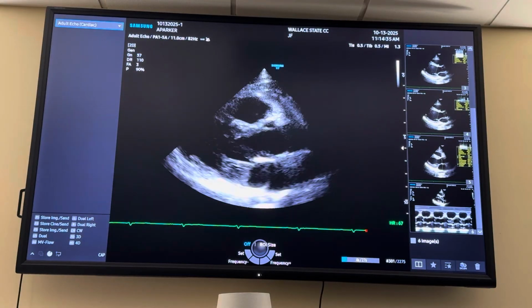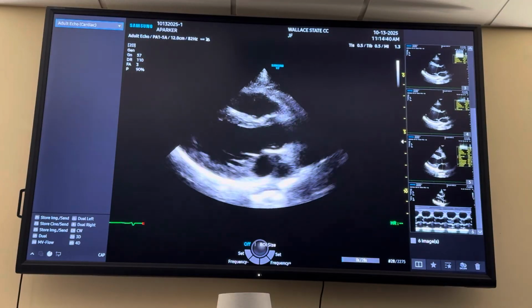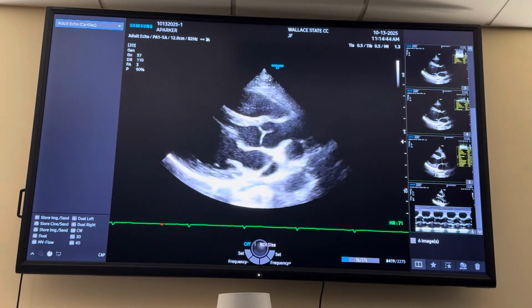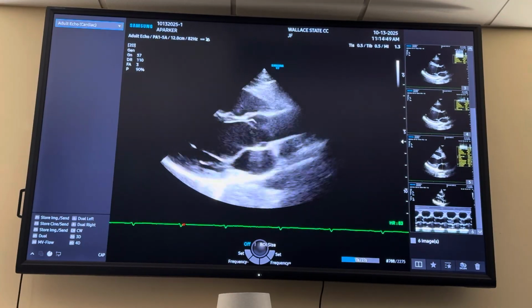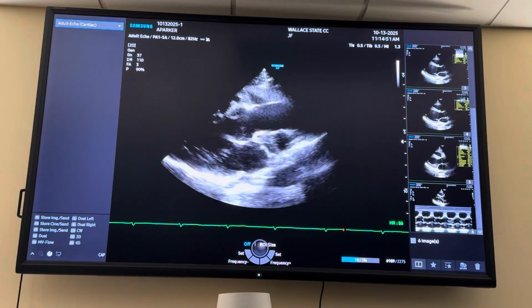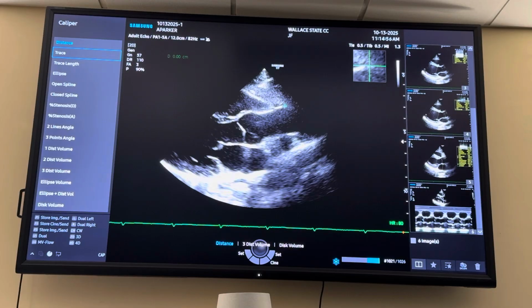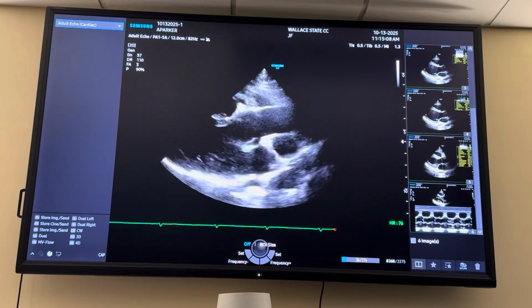If I cannot see her ascending aorta well in her parasternal long, which is fine, that's very common, I'm just gonna slide my transducer, slide the probe up. And now you can see a little bit more of the ascending aorta. Just know where to find that. A lot of your clinical sites are gonna have that regardless if it's part of your protocol. And you would measure it here. Of course, it would go in a package. And really, even if you wanted to do your root in the same, just as long as you include it, you could actually do that. Just remember about your ascending, because a lot of facilities are gonna look at that.